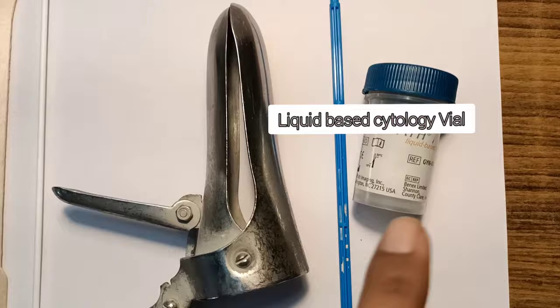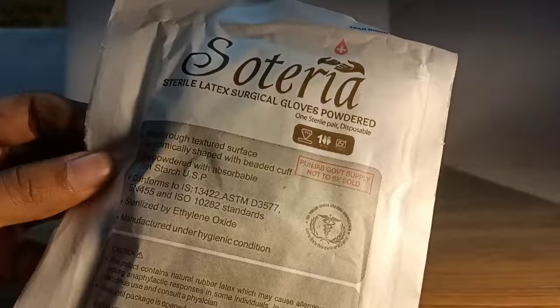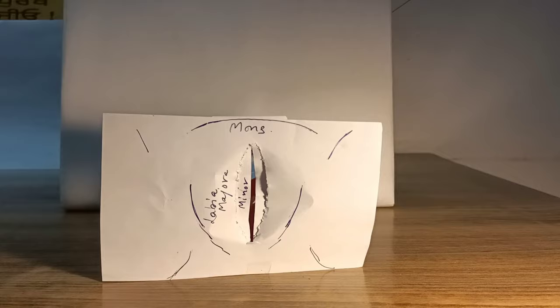Beginning with the procedure, first you need to perform adequate hand hygiene and after that don a sterile pair of gloves as per your size, and then finally you will introduce the Cusco's speculum.